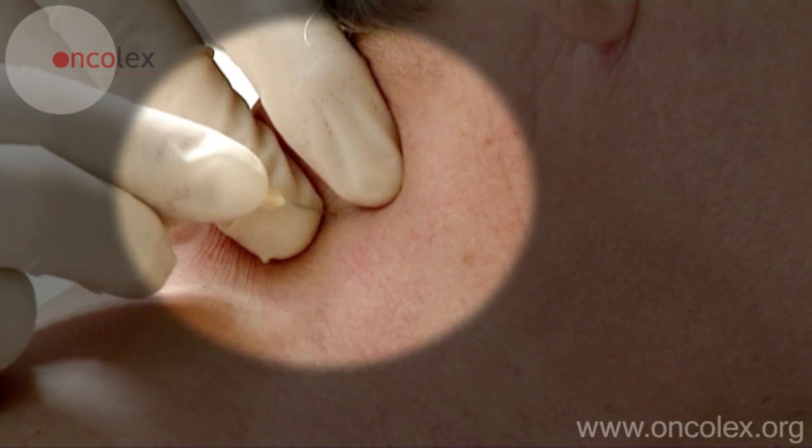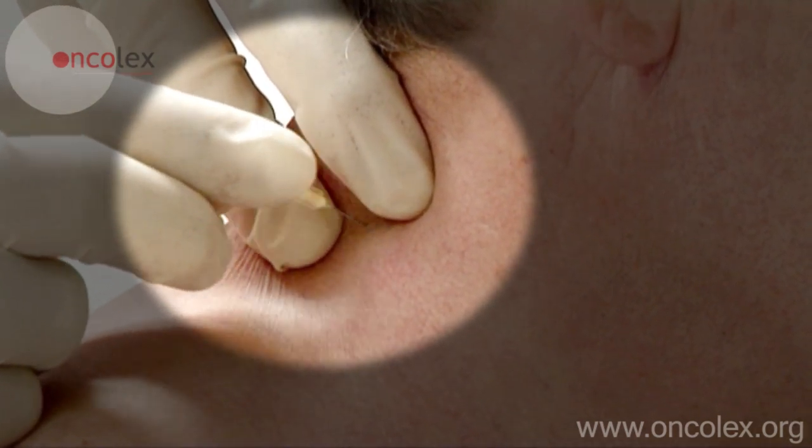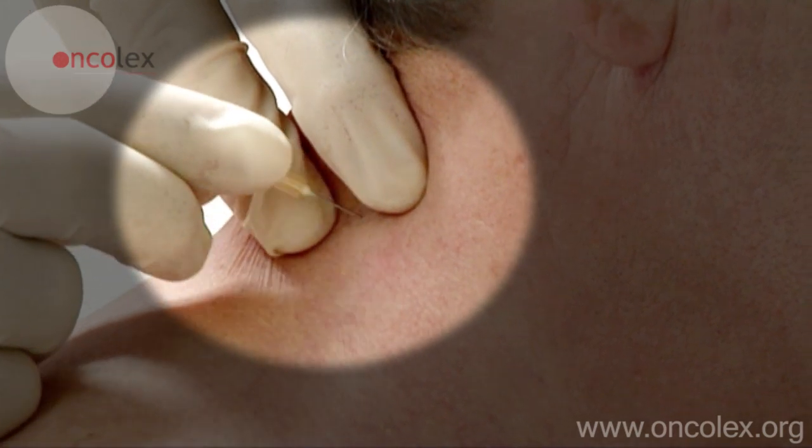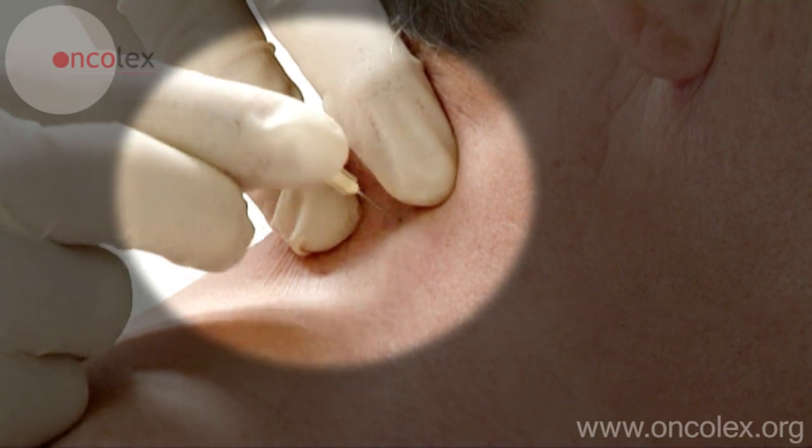The needle is quickly punctured through the skin and then moved back and forth in all directions. When the material is visible in the top of the needle, the biopsy is concluded.